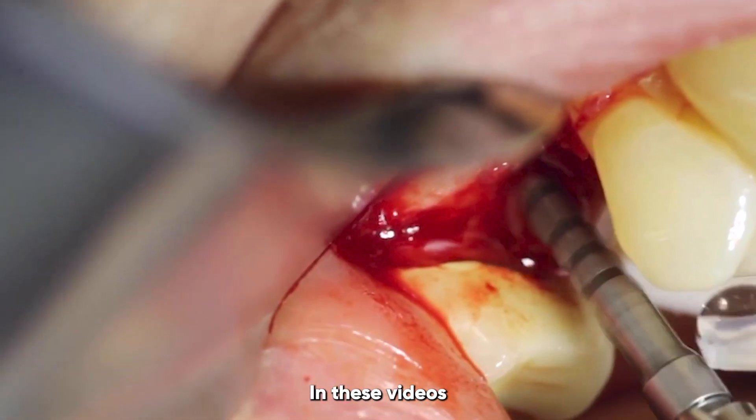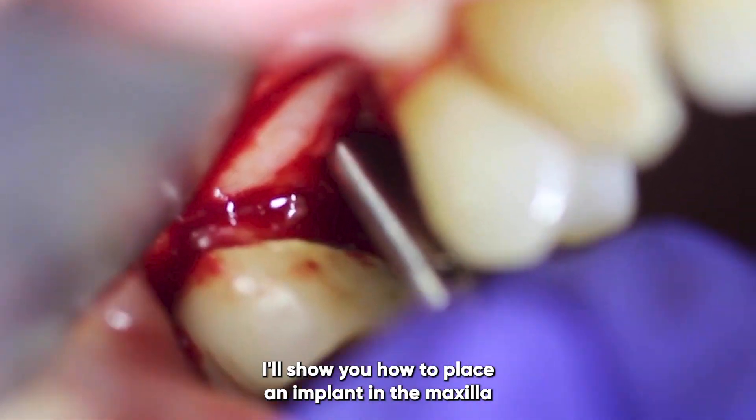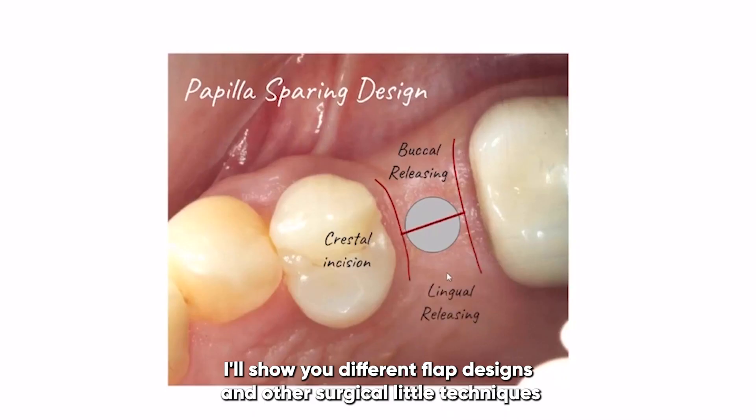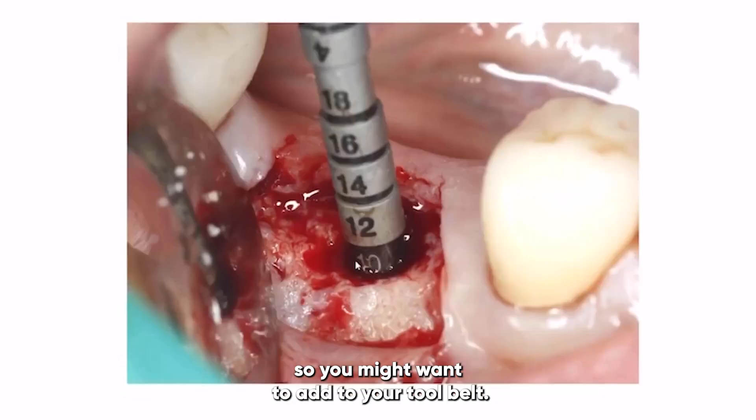Then we'll move on to the patient videos. In these videos I'll show you how to place an implant in the maxilla and even how to breach the floor of the sinus. I'll show you different flap designs and other surgical techniques that you might want to add to your tool belt.